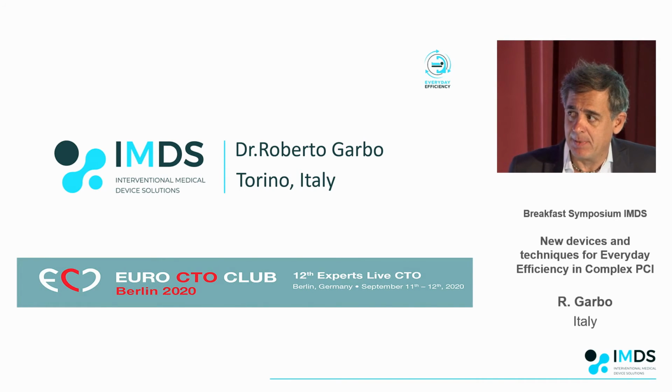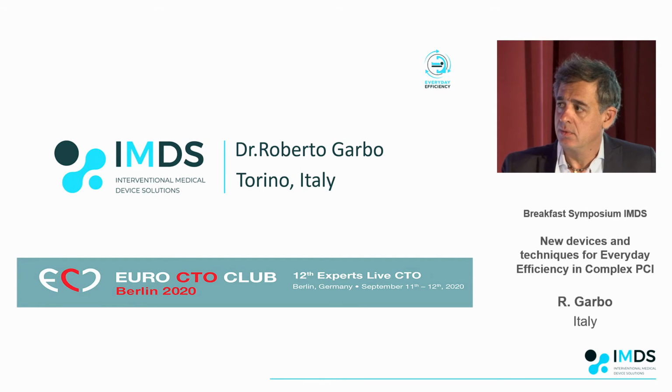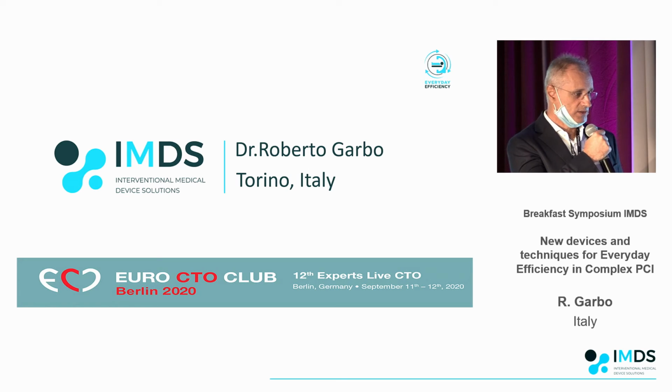And in your step-up approach, do you change the microcatheter, or try to dilate with a small balloon, or go directly with the Blimp? No. I now always use the Blimp. Always. After the first 5-6 cases that showed this success. And actually, a couple of years ago in Toulouse, we did a live case like that in front of an audience, at the EuroCTO Club meeting. So it has also been demonstrated live. It's always working very nicely. And I have no hesitation about safety there. Absolutely not. The major problem comes when you push other devices through collaterals rather than when you cross them.